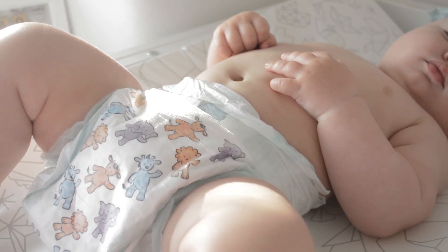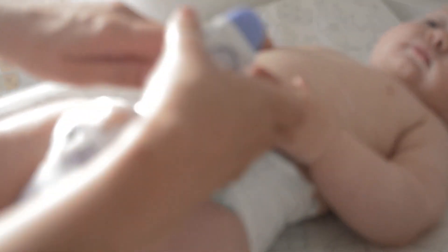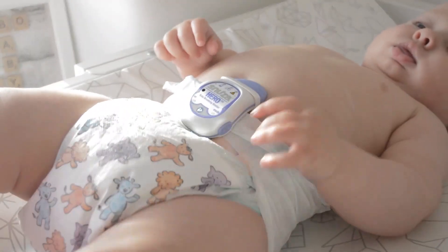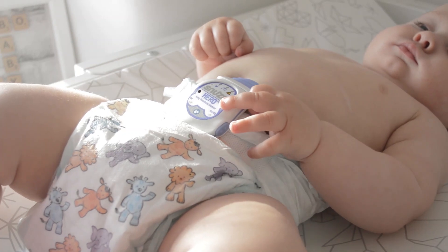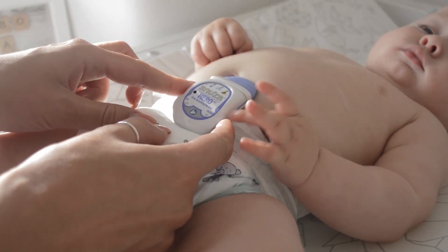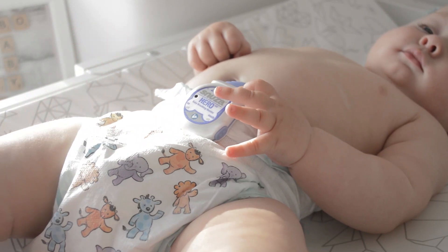I'll show you now how to attach it onto the nappy. You switch it on, which I've already done, and fold the top of the nappy down. You just pull the clip back and then slide it over the top of the nappy and then it just rests gently against the tummy. You can see that the green light is flashing as the baby moves. I'll show you that beeping noise for the breath — you press the mode button on the other side and it starts ticking. You can press that three times for volume and then again just to turn the noise off.